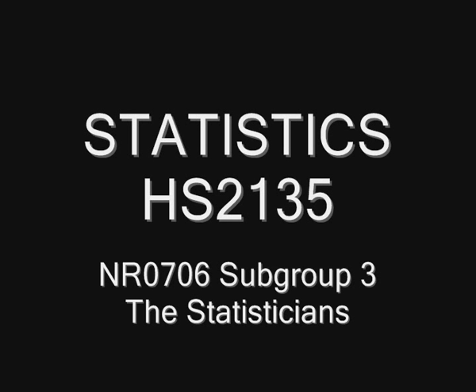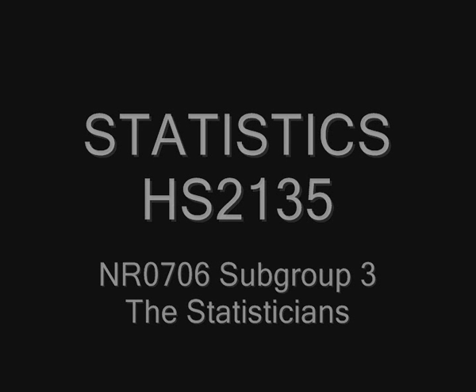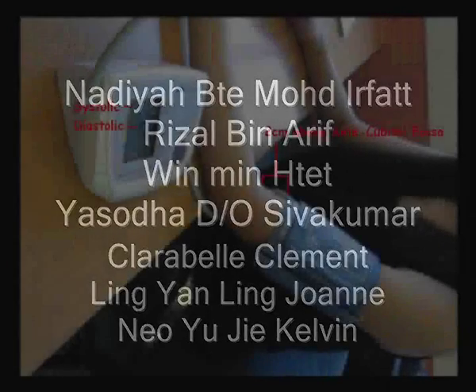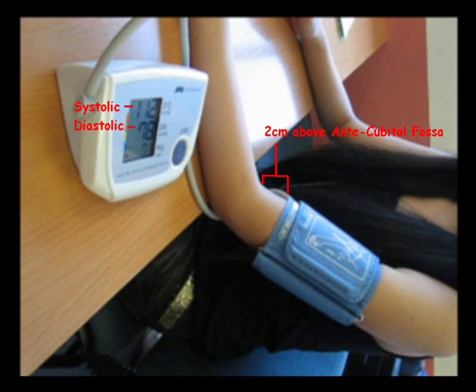This is a short video produced by NRO706 subgroup 3. This video shows us taking a blood pressure of a sample and how we will collect the data.